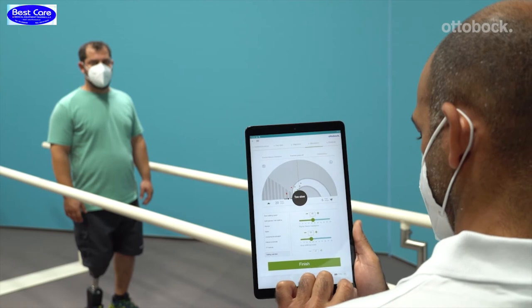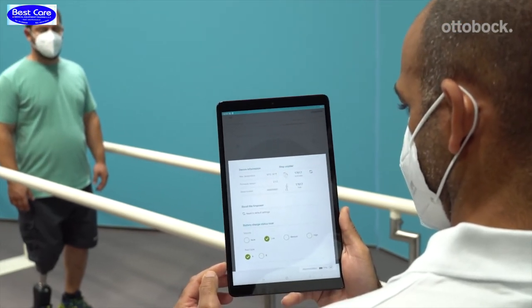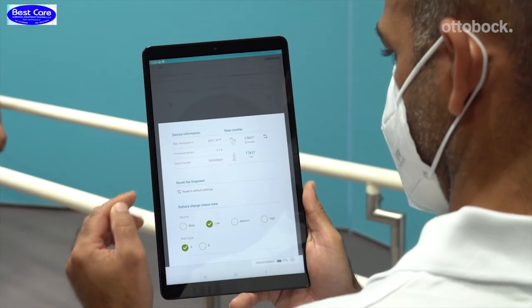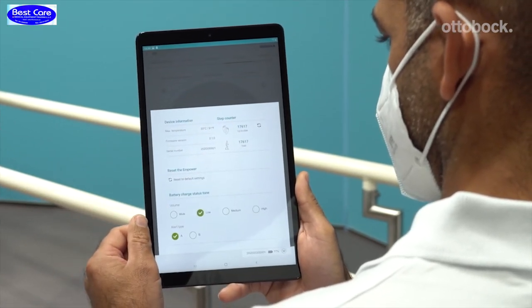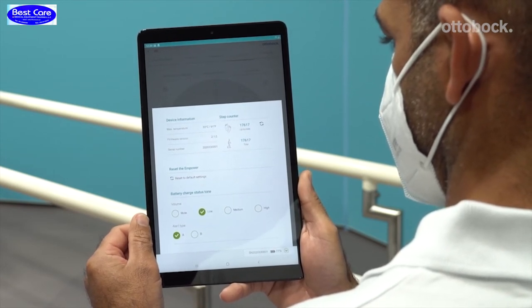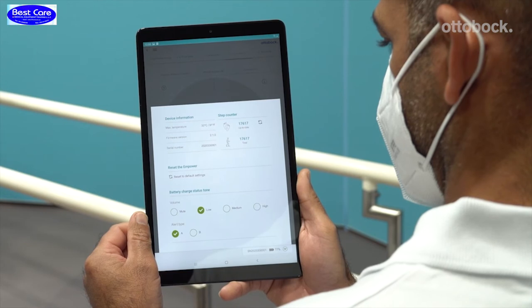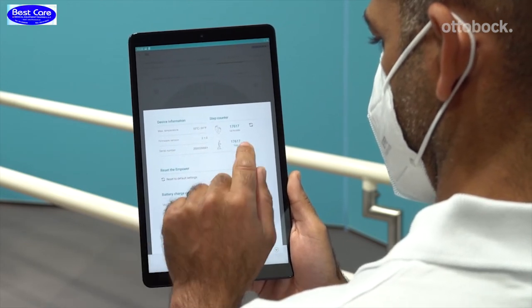By clicking in the menu in the footer, you will find various information about the currently connected Empower. In the upper left-hand corner, the temperature indicator is displayed. Please monitor the temperature regularly while adjusting the Empower, especially while walking on stairs and ramps. Adjust the power settings in case the motor starts to overheat.